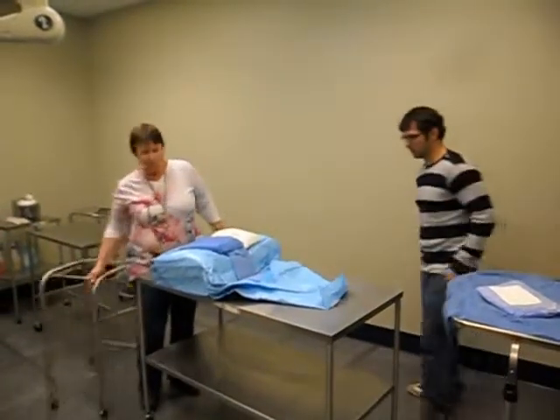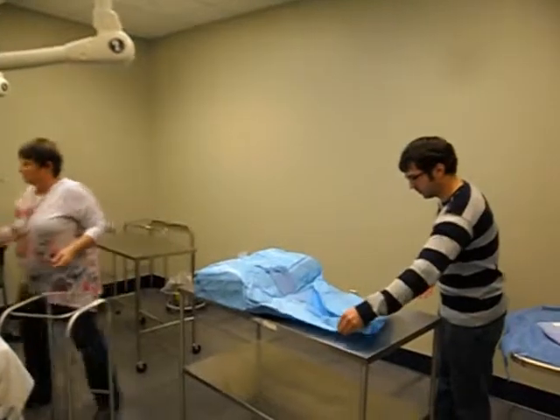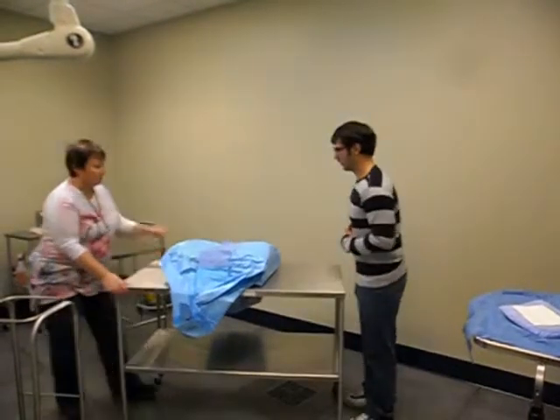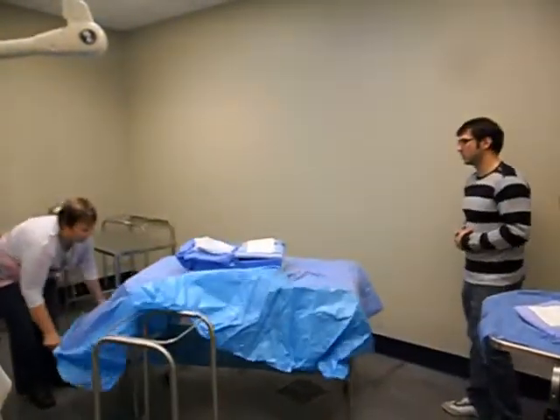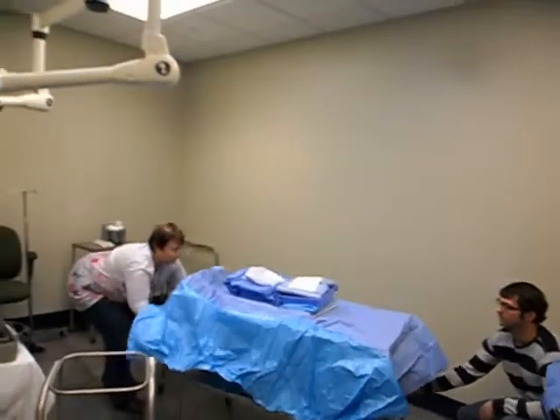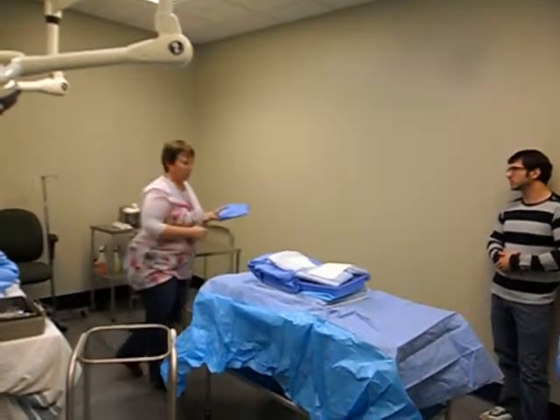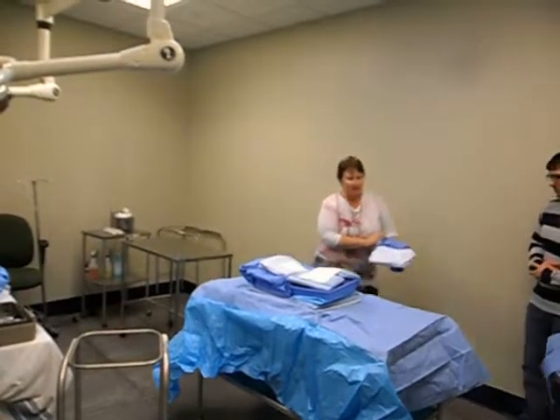So Joel can grab this. And this is your gown, and this is some prep. So we're gonna put this over here. We already opened a gown for Joel. So actually, this has to go this way. So this is gonna be like this. Don't turn your back to that. So grab that and pull down. Okay. Now, I could open up another gown for you, or I could open this gown that came in the pack on the table, but because it's already open, I'm just gonna open this on this table for him.